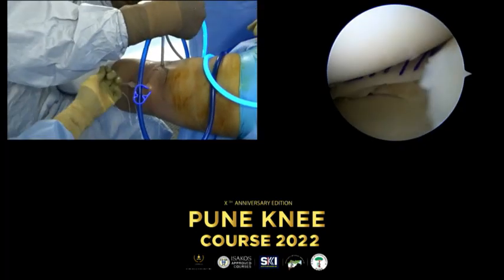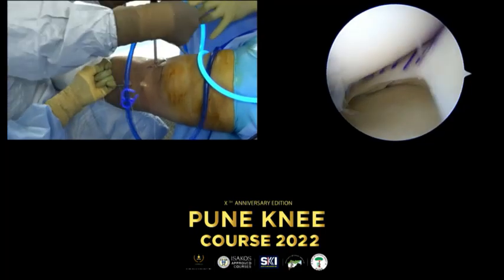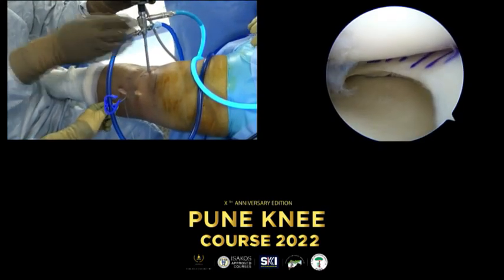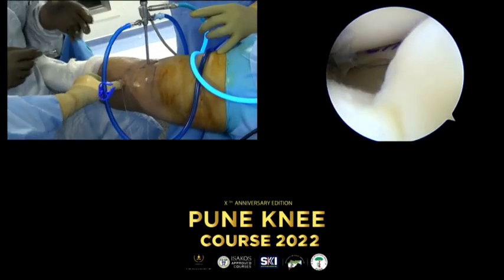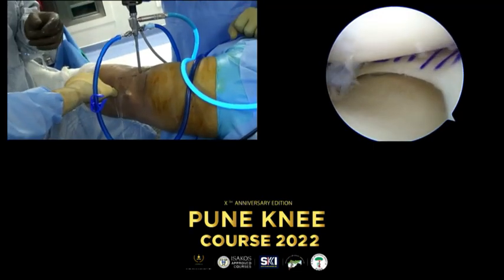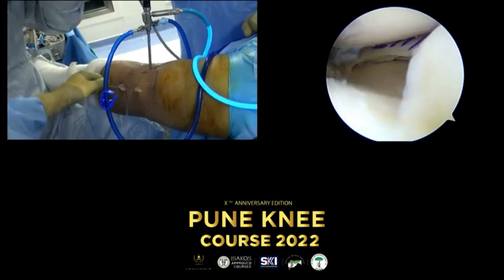So Pablo, as we can see now that you've fixed the posterior third, you've got the root in place, and now your next is doing the anterior root. While we were discussing, what was the angle of inclination that you used on this tunnel to drill the anterior root? At the end, it's not that important, because you know the entry point and the exit point. In the posterior root, you really need to go shallower, so around 40.